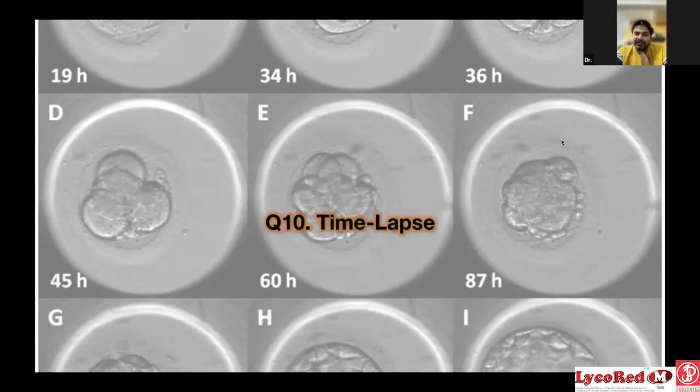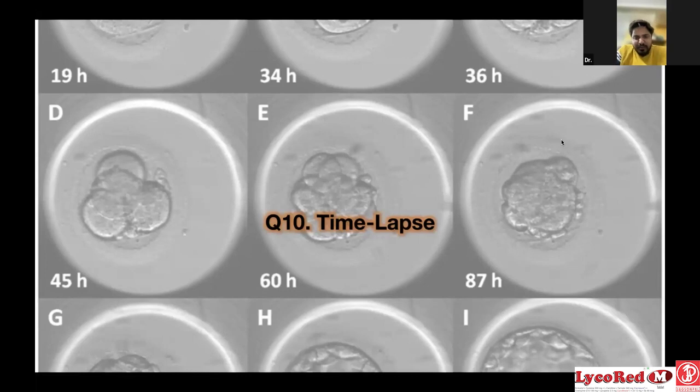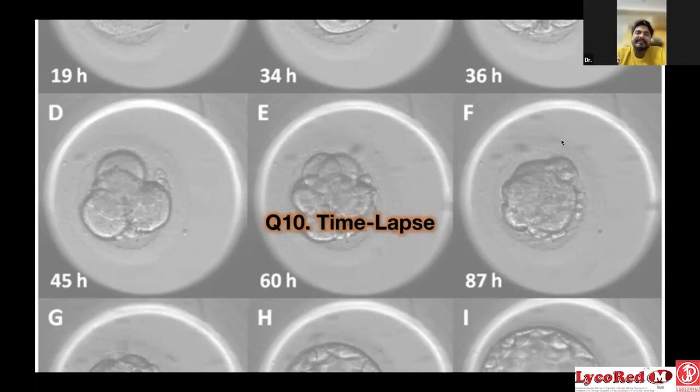It is good actually. The instrument is good, but we need to spend a lot of time to understand what exactly the time lapse has been made up of, that morphokinetics. And blastocyst conversion, we can do in any way. If the culture system is good and the environment is optimum, we can culture to blastocyst; conversion in the box incubator also we can do. Nothing related with time lapse. But again, it is a good tool and a good marketing tool as well, and it is easy to convince the patient, and they have a good price also.